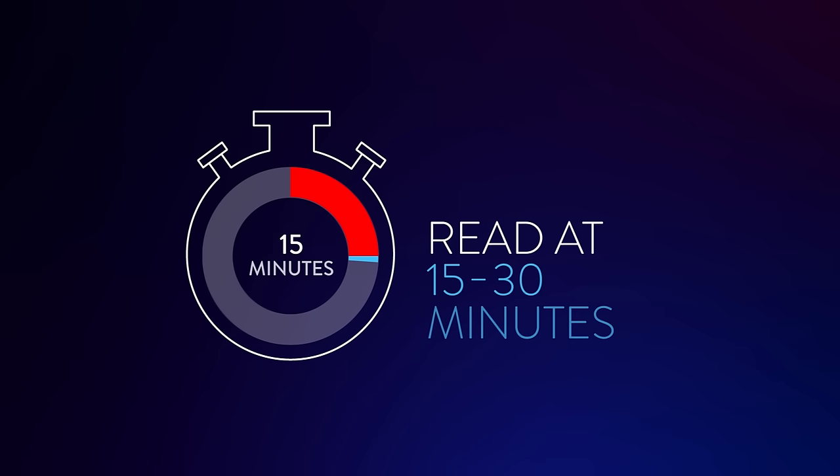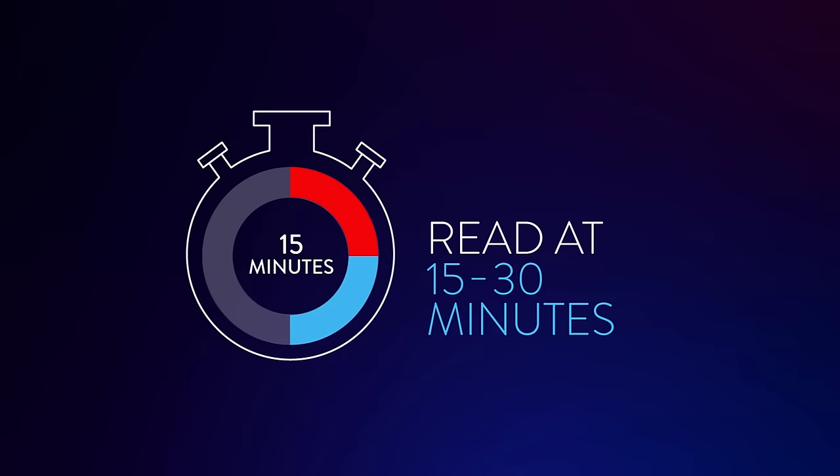After 15 minutes, check your result. It is important to not read the result before 15 minutes. Results should not be read after 30 minutes.